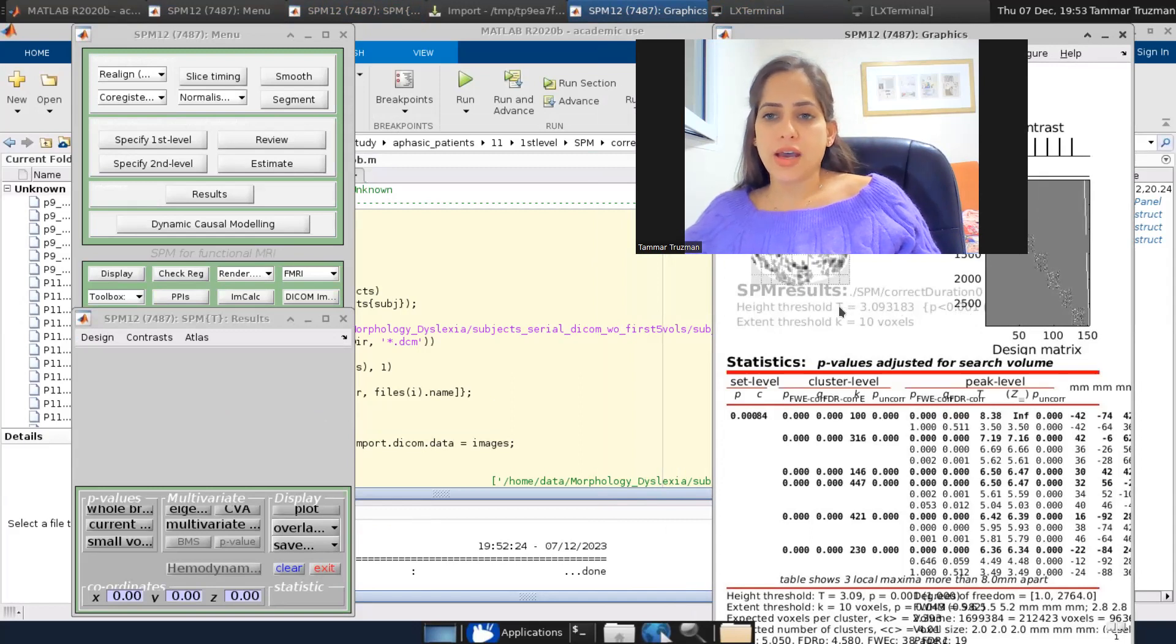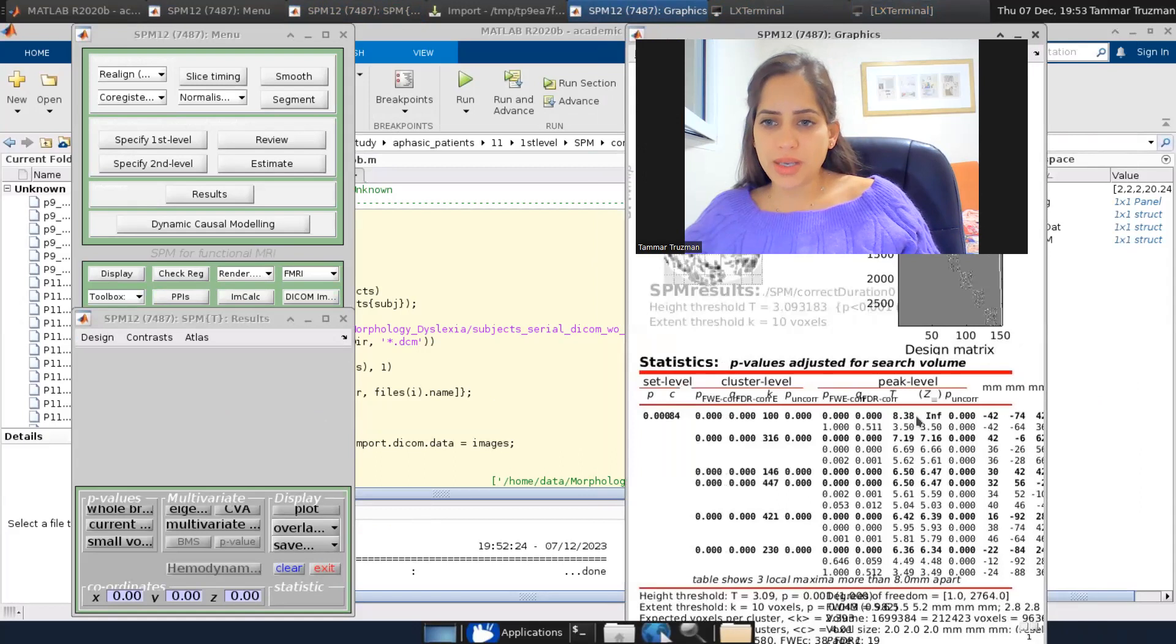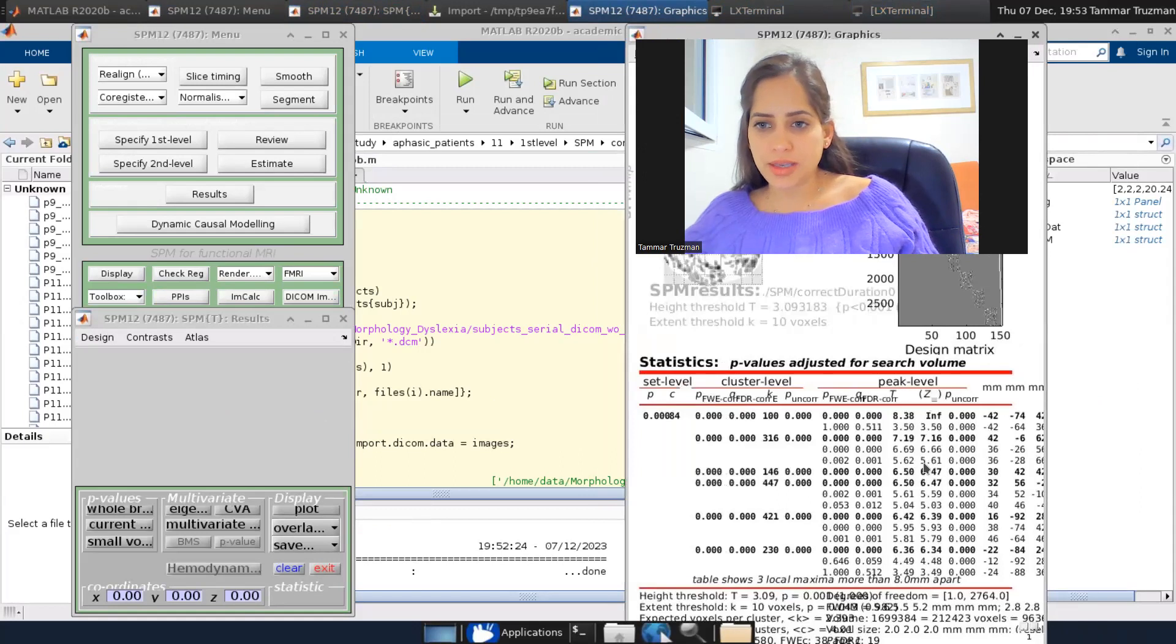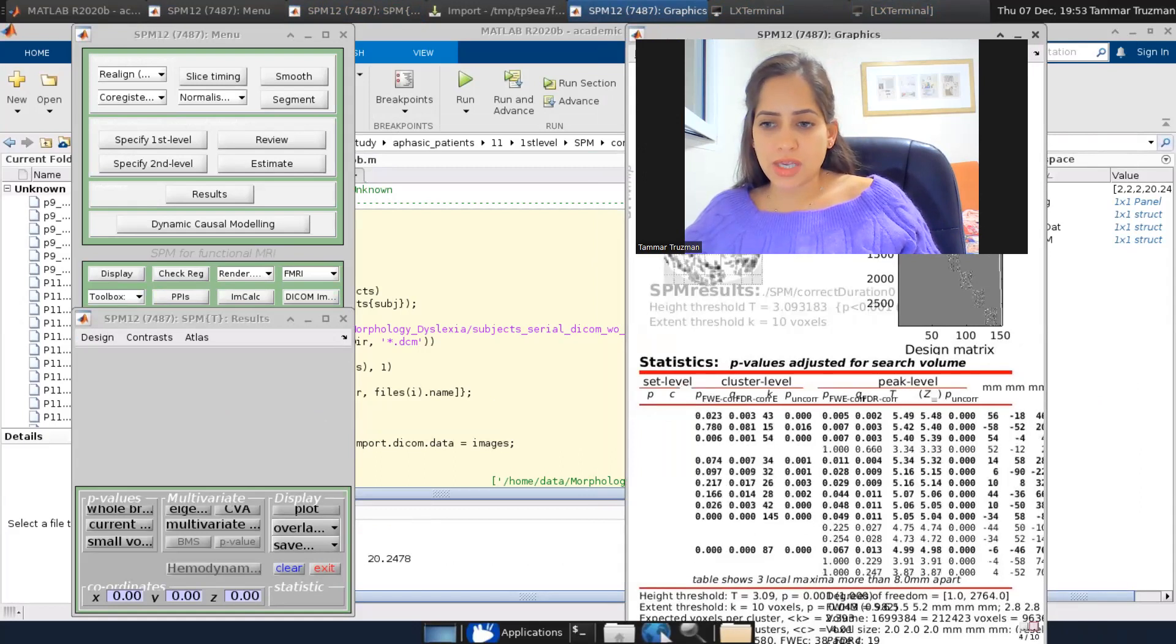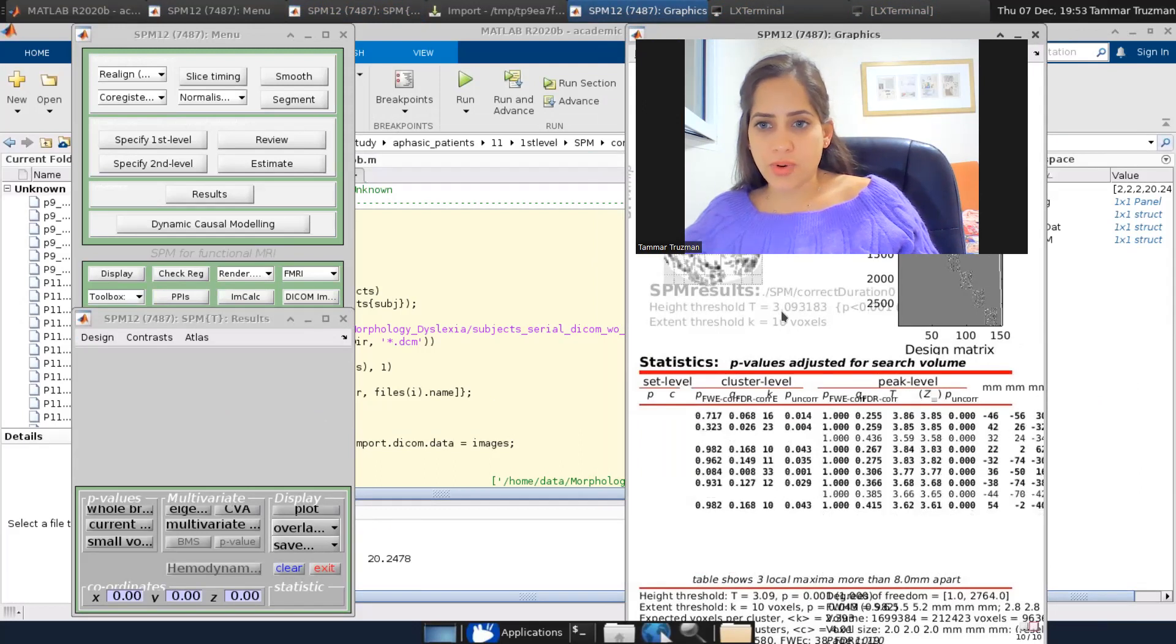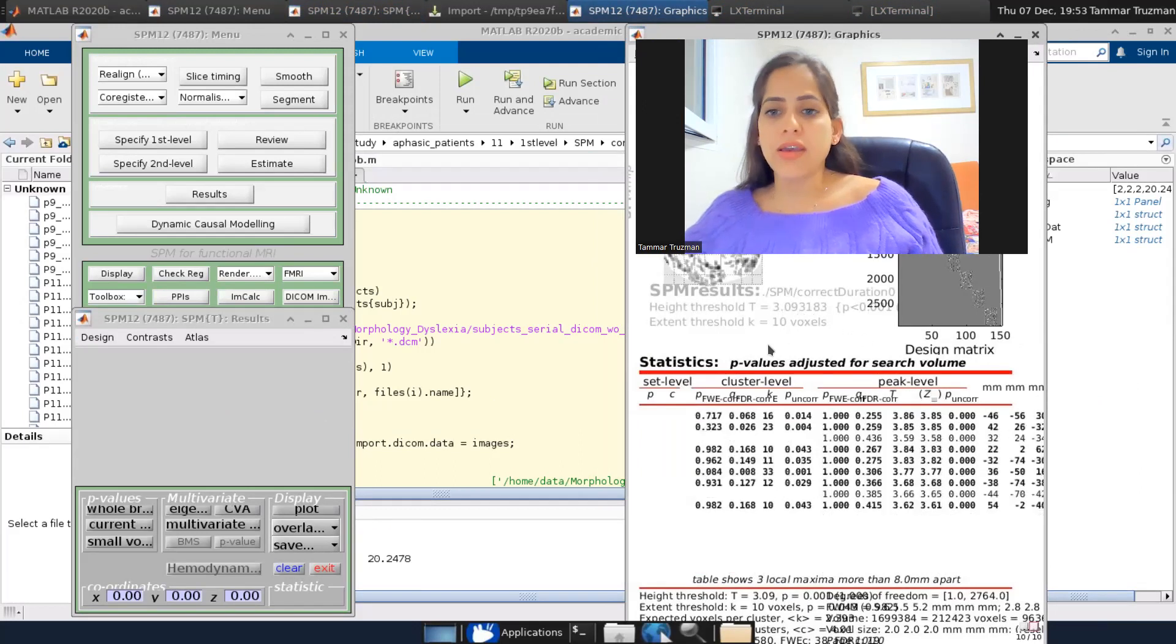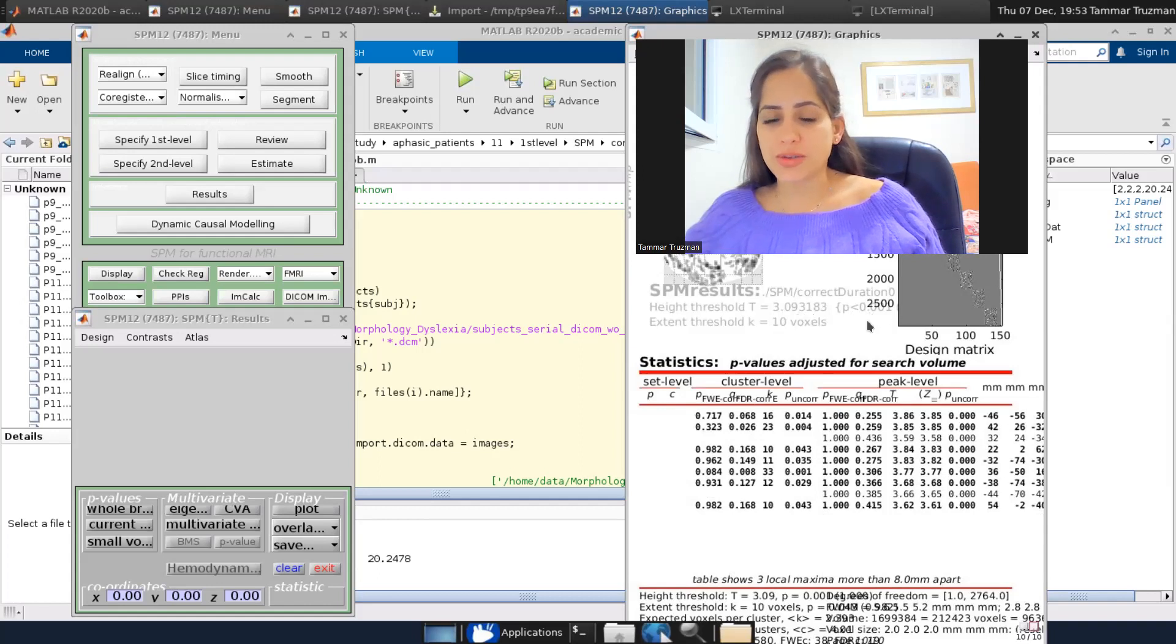This is a T that if we look at the peak level T values here, we can see that there is no T smaller than 3.09, which corresponds to an uncorrected p of 0.001 again.